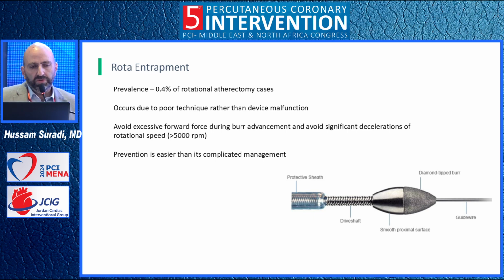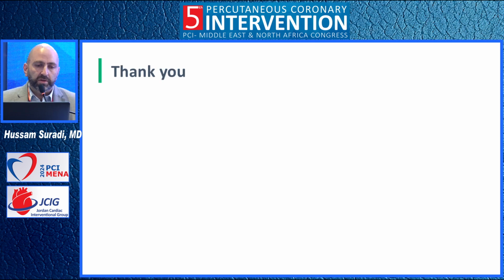Some of the things you need to think about: use a pecking movement, very slow movement, no excessive force. Get your ears used to the way the deceleration sounds. Try to avoid decelerations of more than 5,000 RPMs from the baseline. Overall, this is a very tricky, challenging situation, and if you are doing rotational atherectomy, it's good to be aware of the management algorithm.